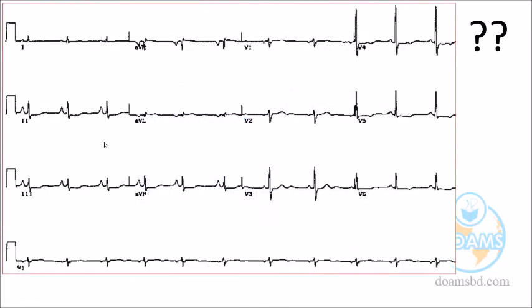Now time for interaction, please. Anyone, raise your hand to identify which atrium is enlarged here, or whether it is normal at all. Guess something, though the squares are not mentioned on the ECG. For general understanding, can you identify? Our attention should be on lead 2 and chest lead V1. Try to identify any abnormality of the atrial size. Please look and let us know.